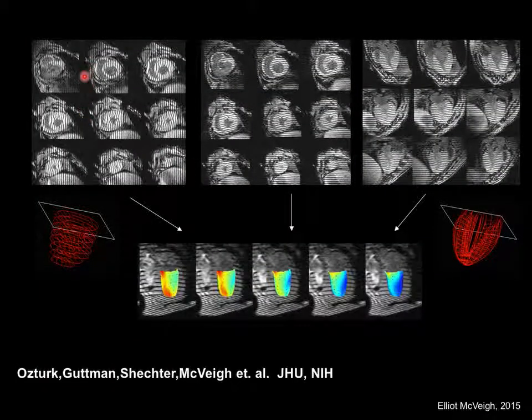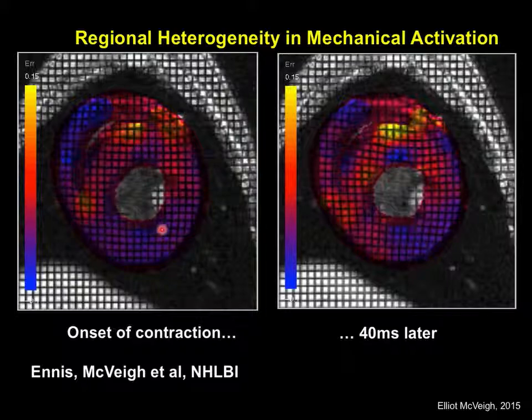So a way of looking at it is I can acquire images with vertical tags to measure horizontal displacement, horizontal tags to measure vertical displacement, and then in the orthogonal direction to measure the displacement through the imaging slice, where these two images are in the same slice. This one shows how things move up and down through that slice. And so with those three sets of tags, you can find these displacement planes and solve completely for the three-dimensional displacement field in the heart, and then overlay on top of your heart what the strain values are, right?